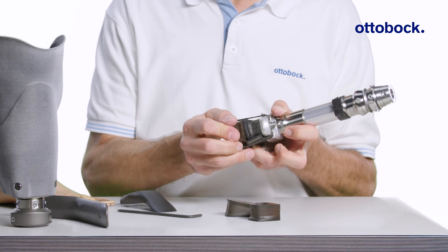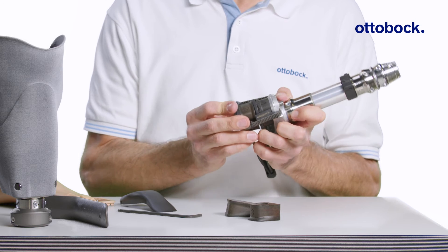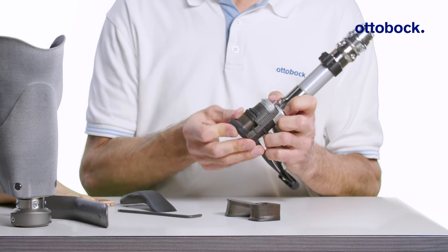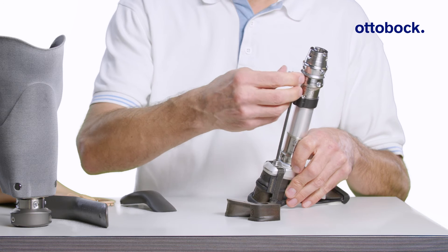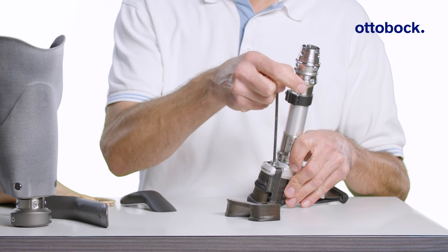After the wedges are installed, ensure the tension band is properly seated on the plantar surface, then fully tighten the 4 mm allen screw applying 4 Nm torque.